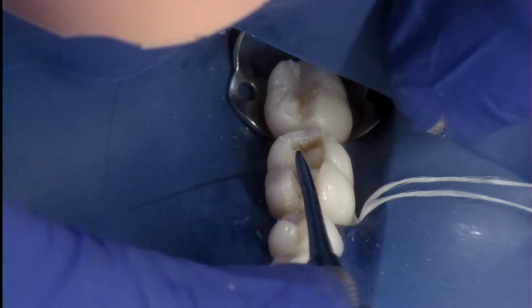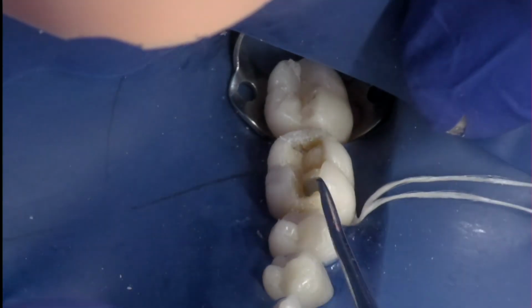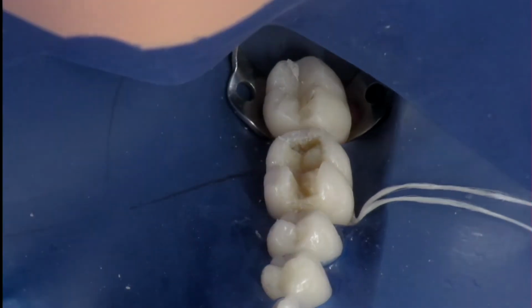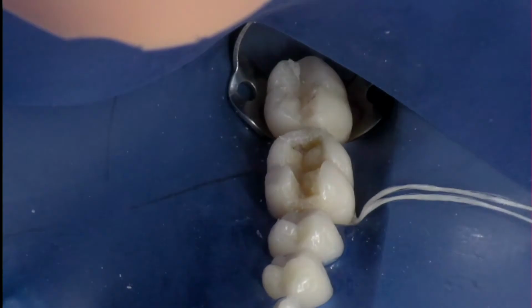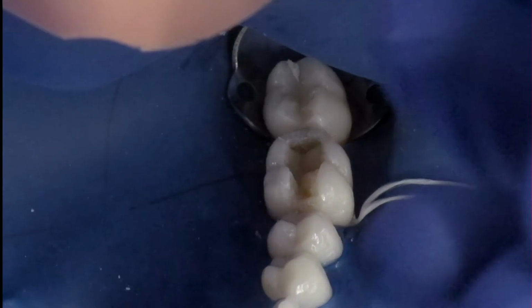Now here you notice the two triangular ridges on the posterior or the distal kind of meet up with each other exactly, and that kind of gives a weird look to the tooth. So I kind of go back and bring that, with my next application, bring the buccal cusp triangular ridge a little bit to the mesial to give it a little bit more of a natural feel.